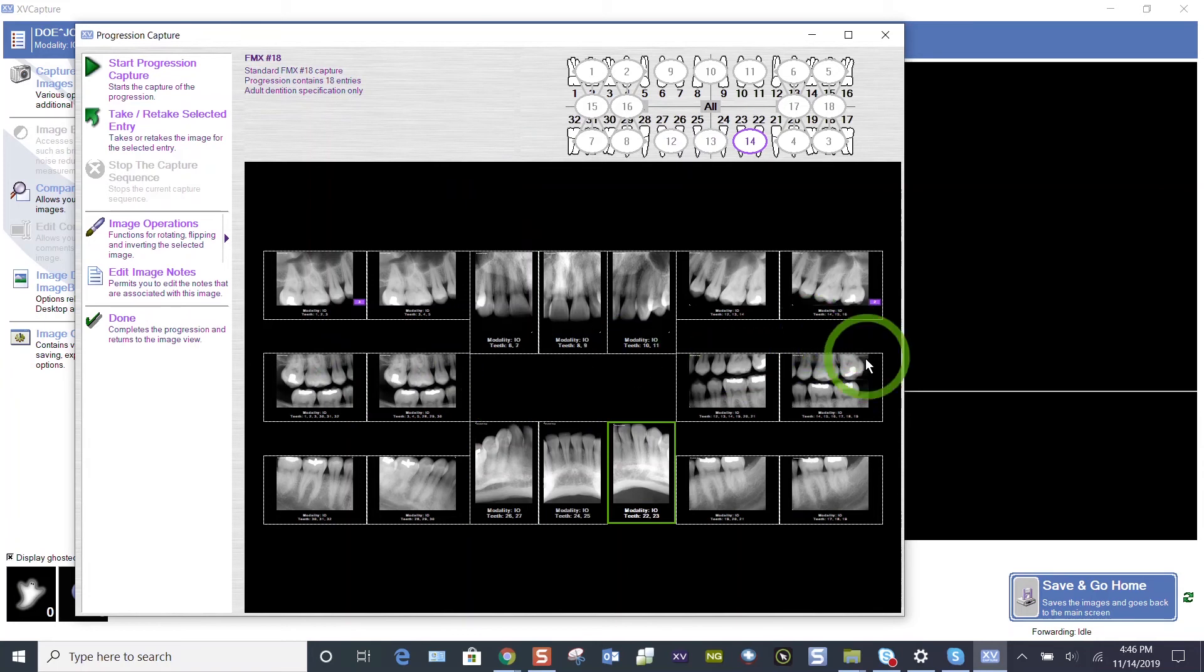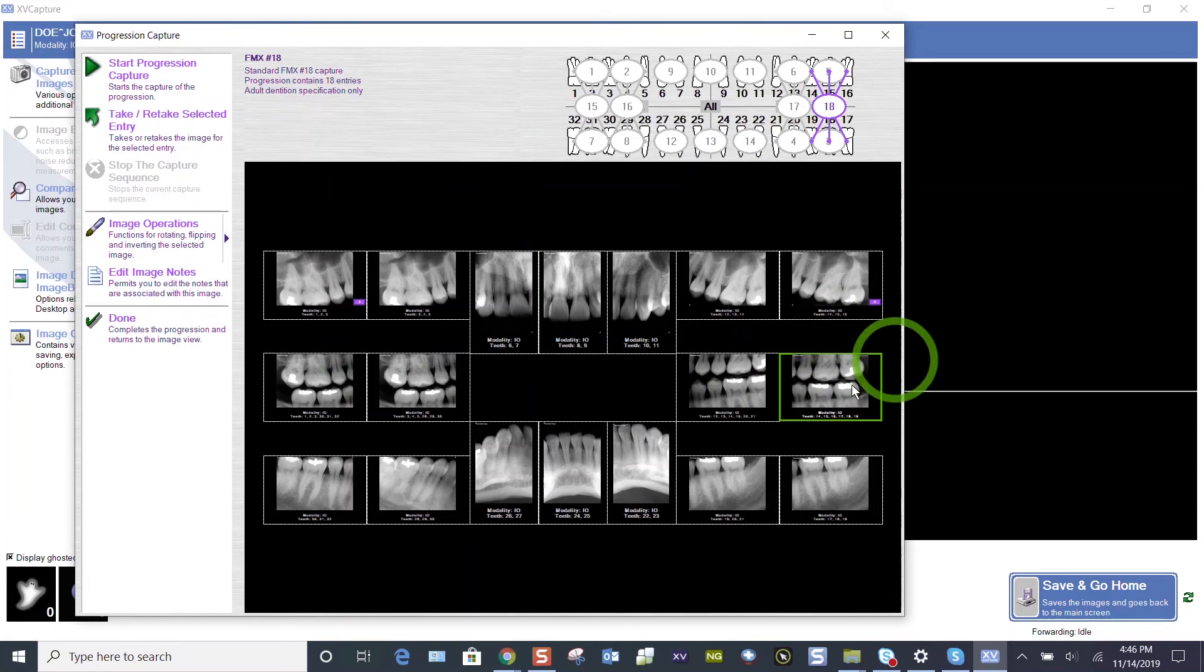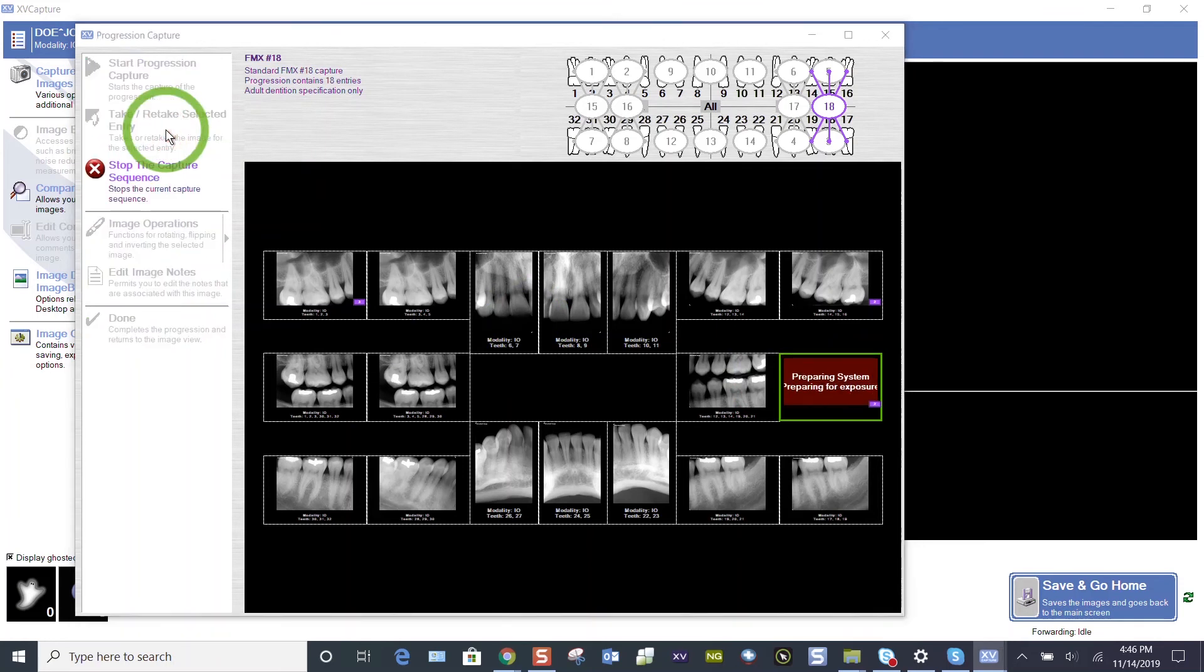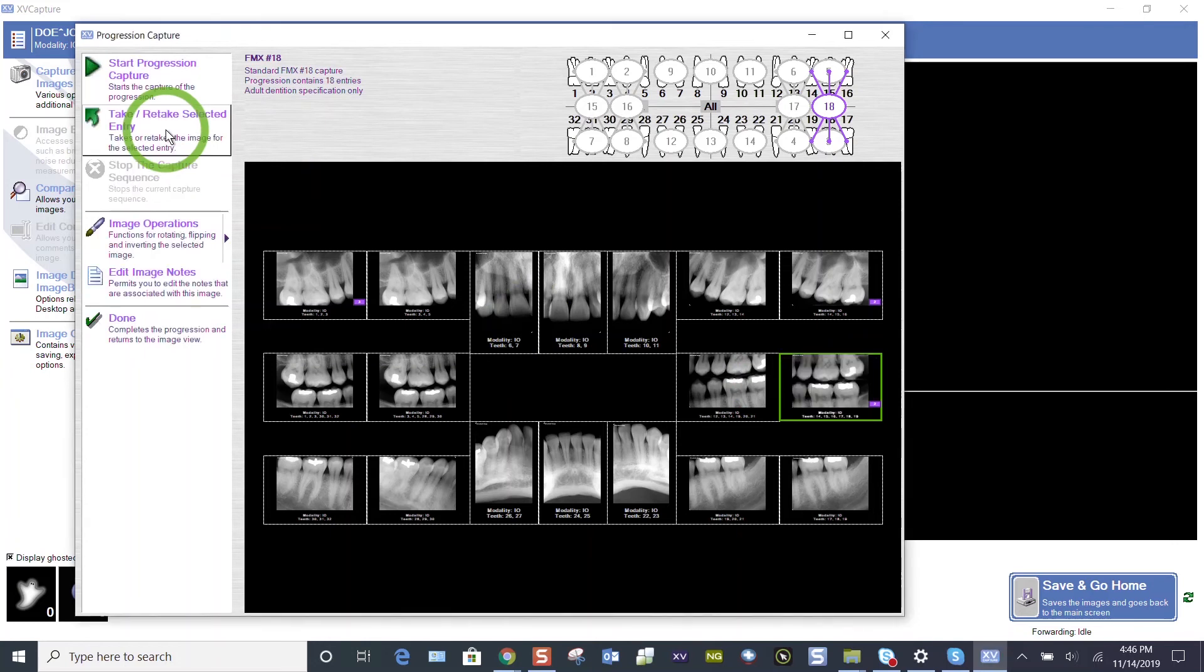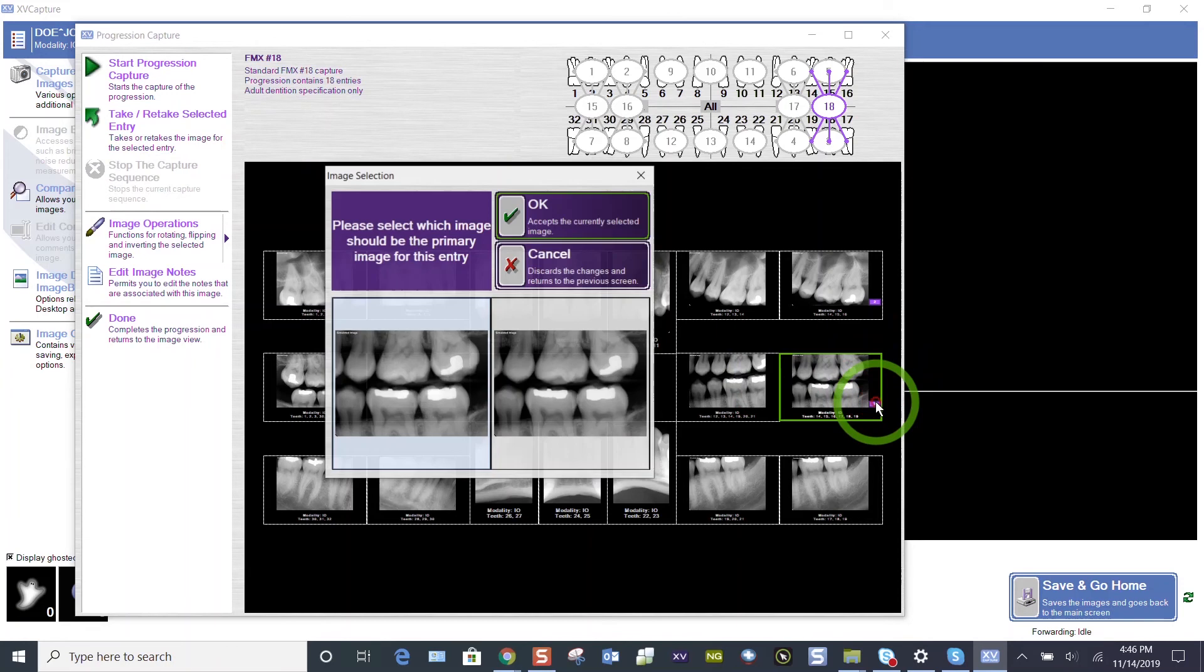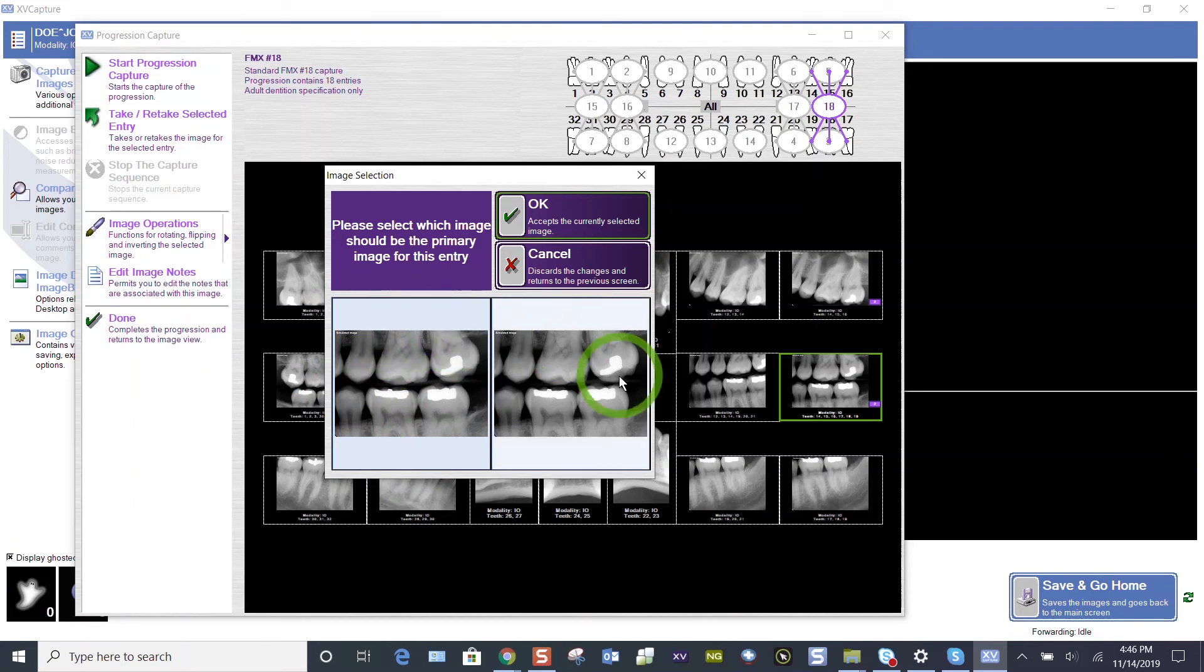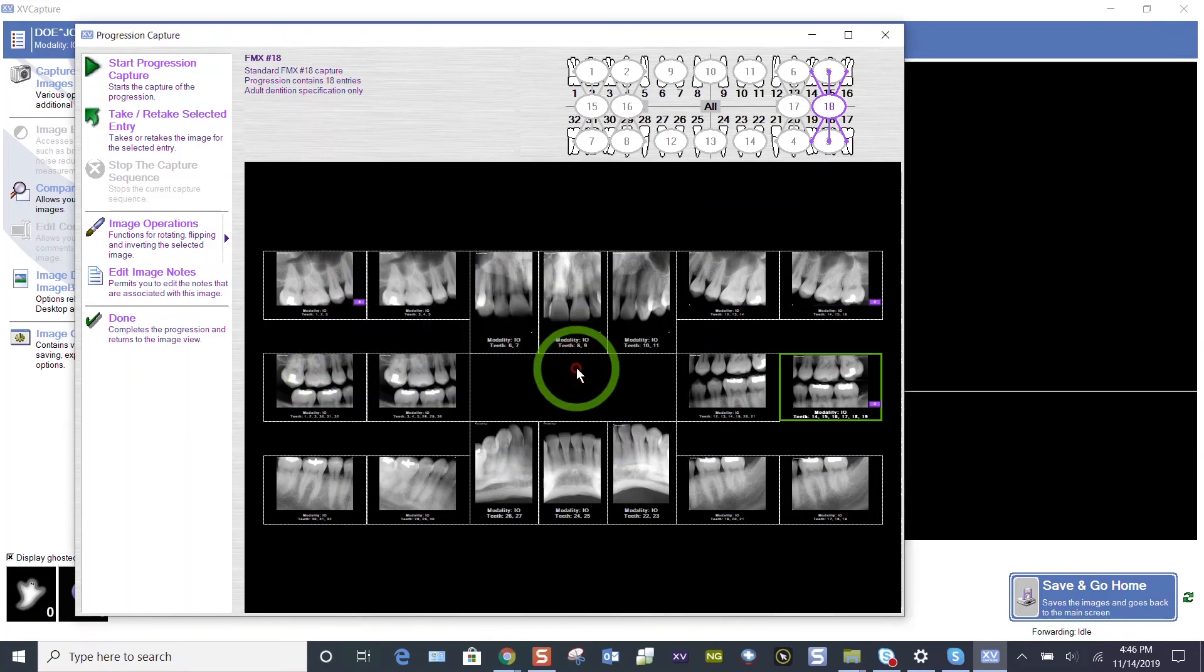So let's choose the left molar bite wing to retake it. Let's just highlight whatever image needs to be retaken and choose the take retake. That way it won't progress to the next tile. It's only going to take that one image. Start. Yep. And the sensor is going to be ready. We're going to take the image and now I've got that number two there. The one that's highlighted blue is my latest image. The one that's on top, hopefully one's better than the other. And I can simply double click to choose which image I prefer.